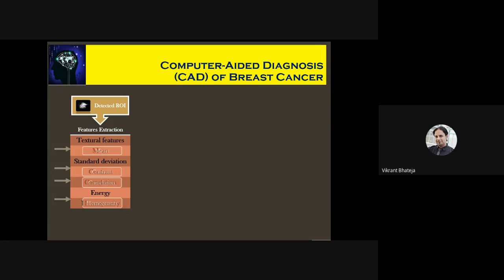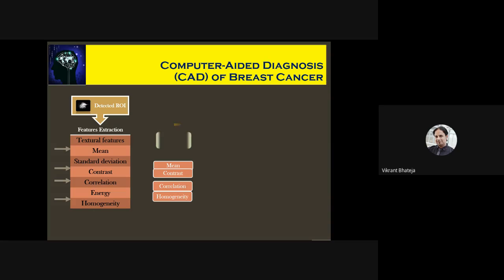That is what we are doing in the feature selection stage. We have not taken all the features, but on some basis of decision making we have selected certain features, or optimized certain features. This is what happens under feature selection. And once feature selection is done, say now you have a pool of 4 types of features over here.